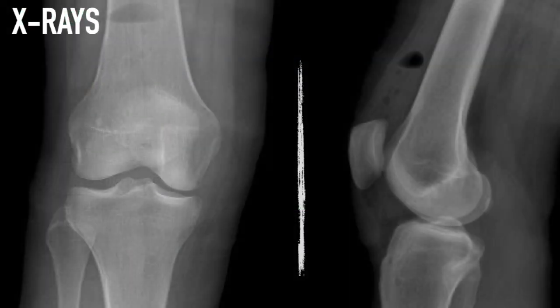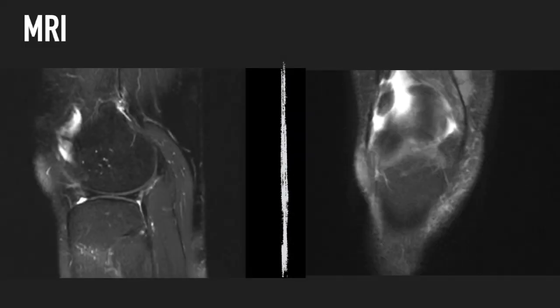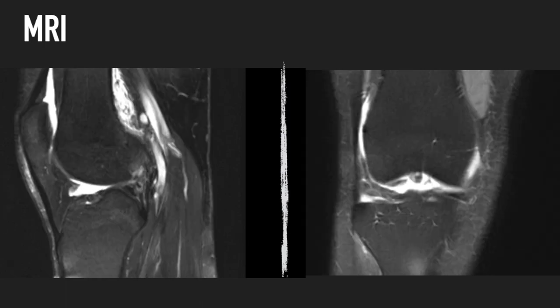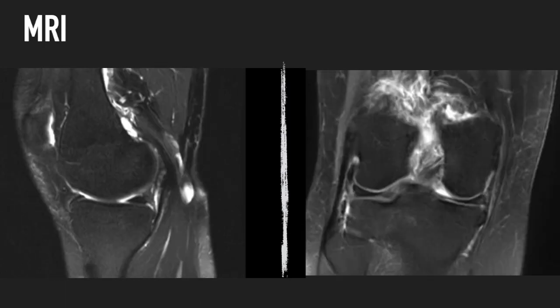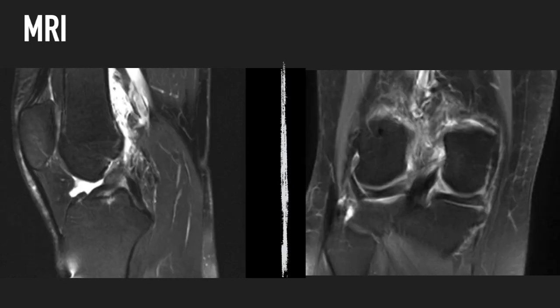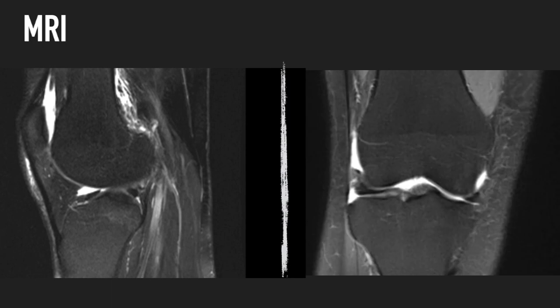Weight-bearing x-rays showed no signs of arthritis, malalignment, or major pathology. Sagittal and coronal MRIs demonstrate an elongated and avulsed ACL from its femoral attachment without any rupture sign. No concomitant cartilage or meniscal injury was seen on the MRI examination. As such, we conclude a diagnosis of a deficient ACL and proceed with a repair.